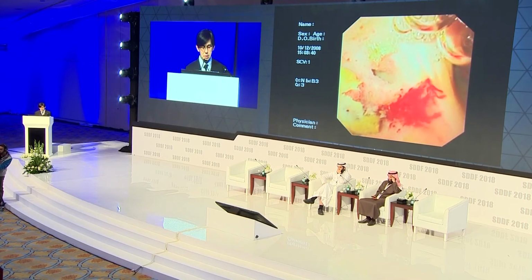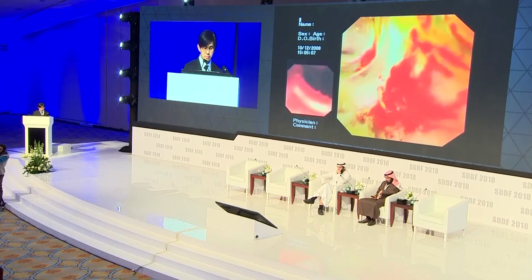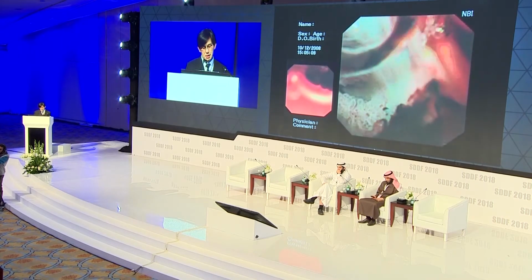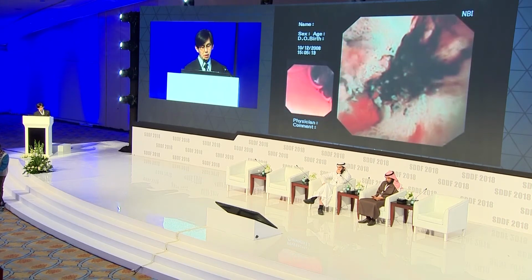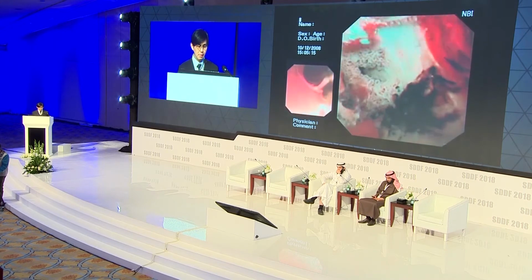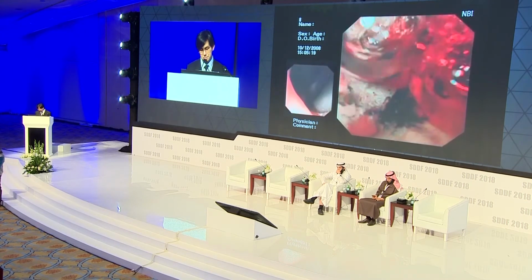This is at the origin of the left duct, and you can see this fish scale appearance, but on biopsy this was actually non-neoplastic, and in this patient, he avoided a left hepatectomy.